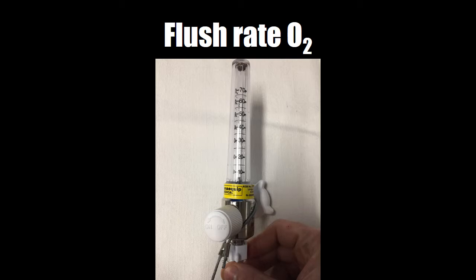Now there's a trial out of the States where their flow meters, if you over crank them beyond 15 litres, the flow increases even though your rotameter at the top here is still reading just above 15 litres, but their flow meters actually get up above 40 litres per minute. And when they studied this with a flow rate above 40 litres per minute, they're getting an expired oxygen concentration of 86% with a non-rebreather alone, so that's not even with nasal cannulae. And that's better than an anaesthetic circuit. An anaesthetic circuit has an equivalent scoring about 81% for your expired oxygen measurements.